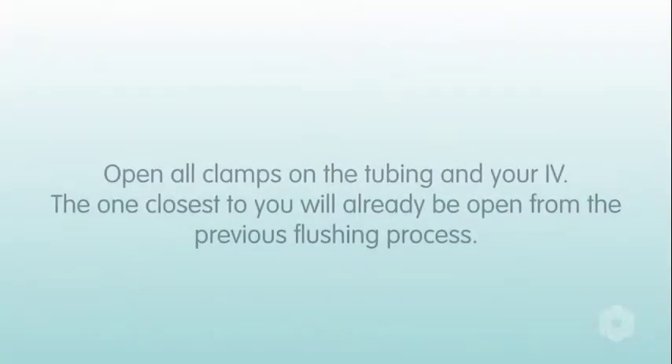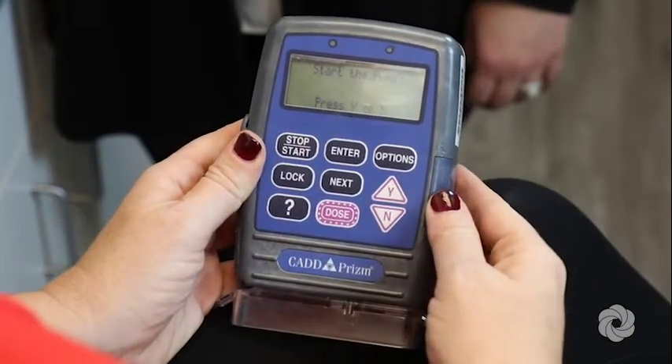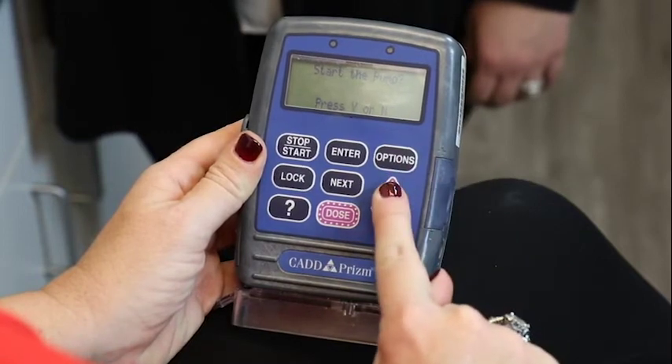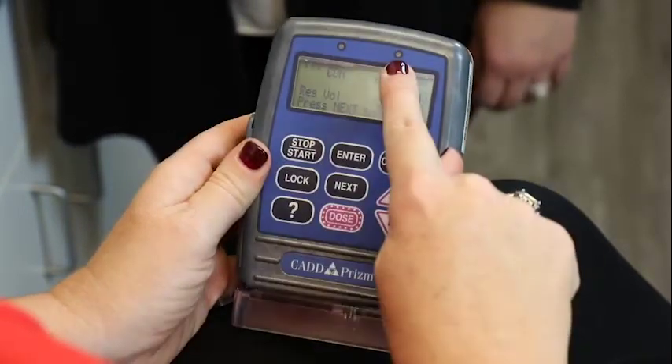The clamp closest to you will already be open from the previous flushing process. Press the Start-Stop key followed by the Y key when prompted to begin the infusion. You will know the pump is running when the green light is blinking.